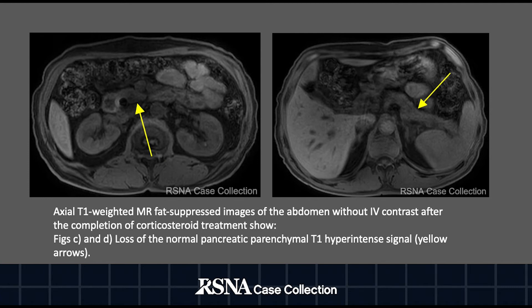Axial T1-weighted, MR fat-suppressed images of the abdomen without IV contrast after completion of corticosteroid treatment show, in figures C and D, loss of the normal pancreatic parenchymal T1 hyperintense signal, shown by the yellow arrows.